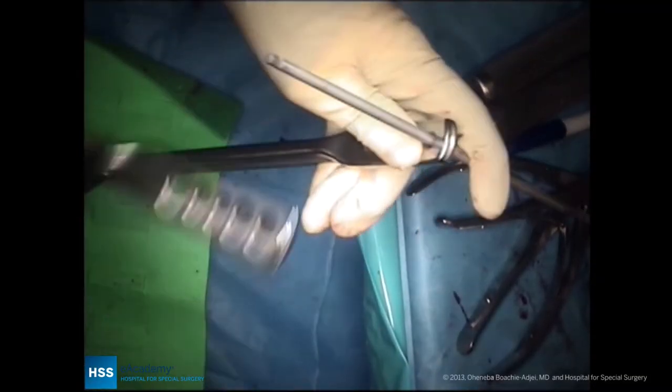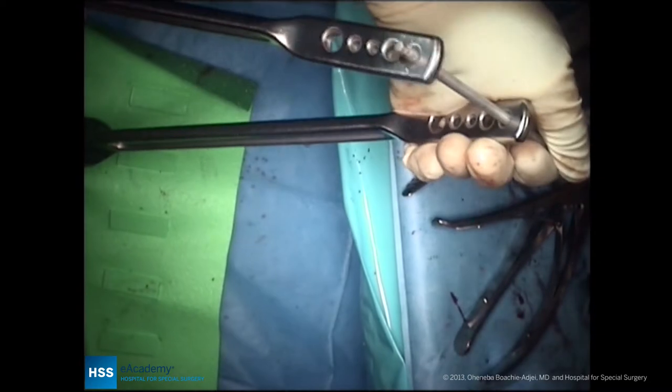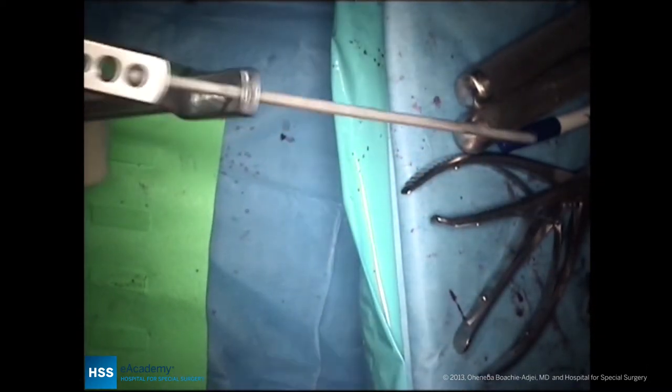The rod bending is now being done. We're using the regular 5-5 cobalt-chrome rod for the concavity, and on the convexity we'll use again a 5-5 cobalt-chrome rod.